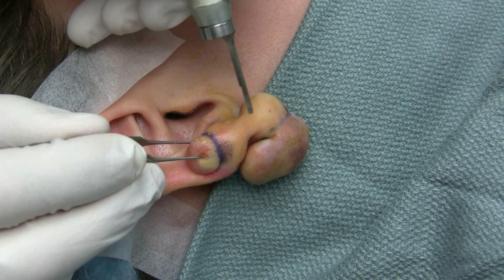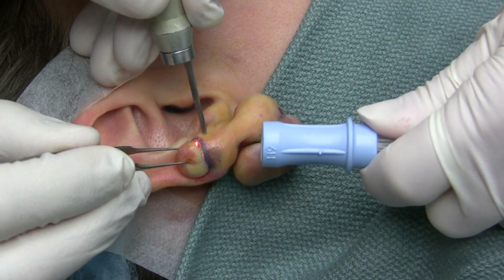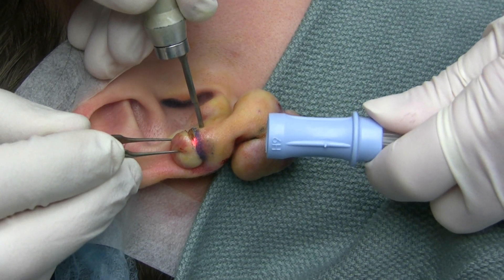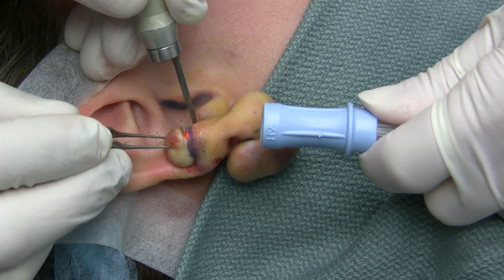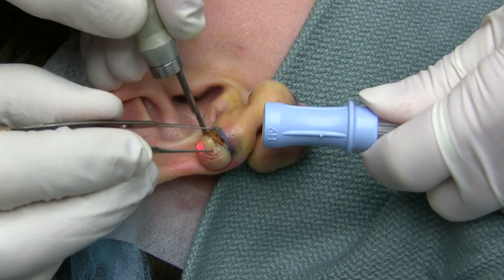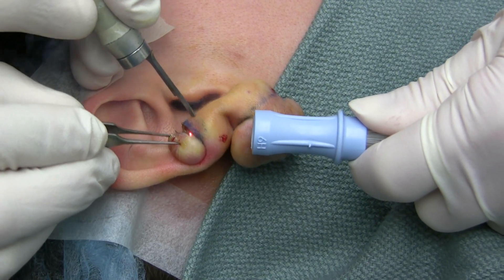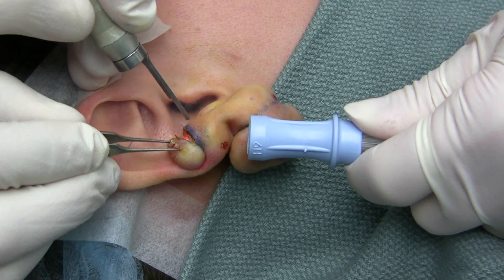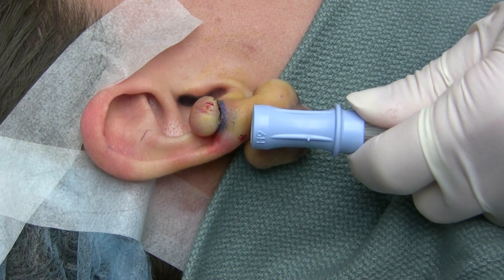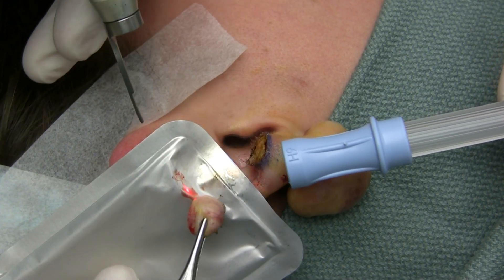Removing this keloid, we're going to start out with the Luminous Encore laser and we'll be using this for our bloodless incision — and you notice there is no blood. So there is our primary excision.